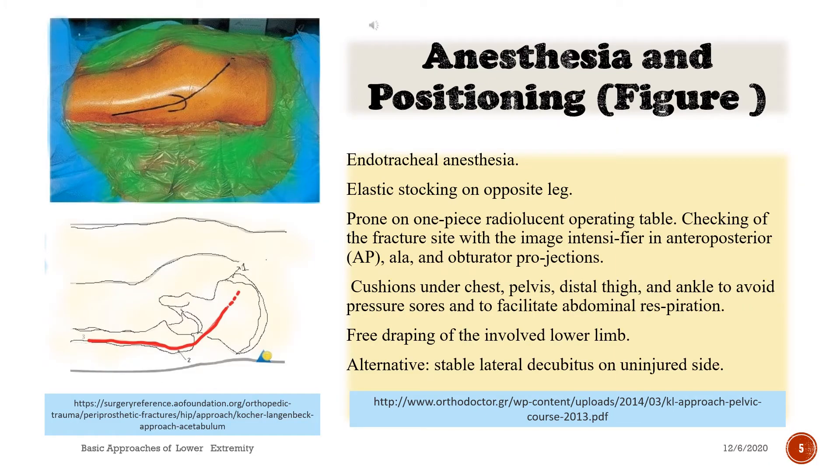Anesthesia and positioning: endotracheal anesthesia, elastic stocking on opposite leg, prone on one-piece radiolucent operating table. Checking of the fracture site with the image intensifier in anteroposterior (AP), iliac, and obturator projections.